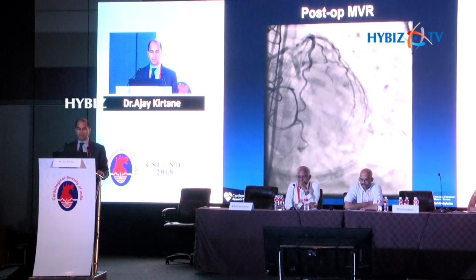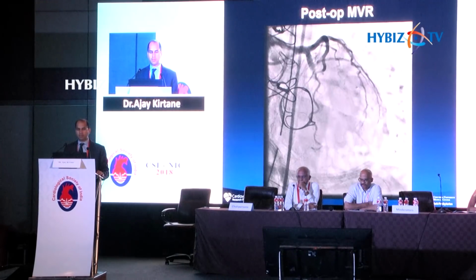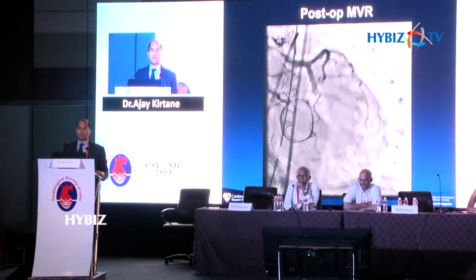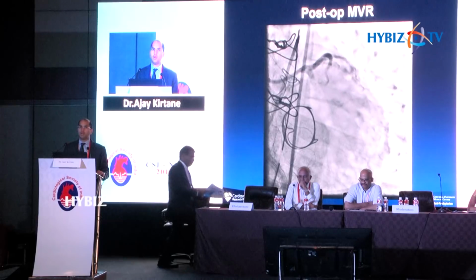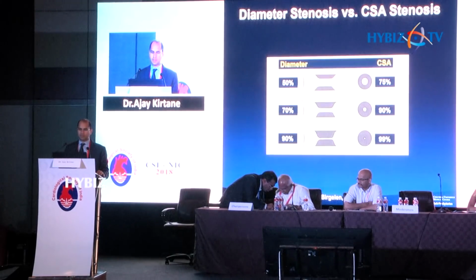There's no clear epicardial stenosis that you see in any of these areas here, but here's the mitral valve ring, and there's an abrupt cutoff of the circumflex right at this location because it was sewed by the mitral valve ring. So it's important to recognize everything that's going on and to piece together the anatomy. You don't see anything filling this area here at all, and that's because this was pinched in this way, and so this was actually opened percutaneously, thankfully.